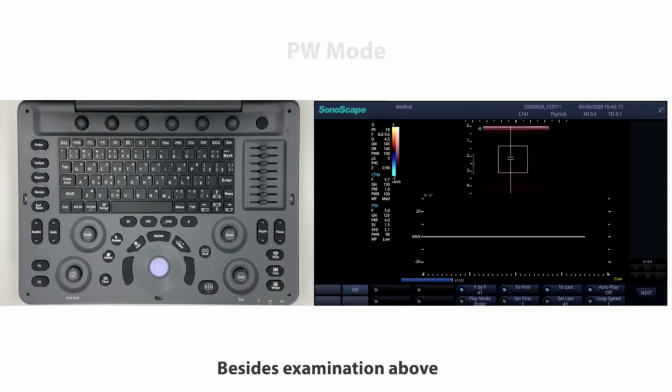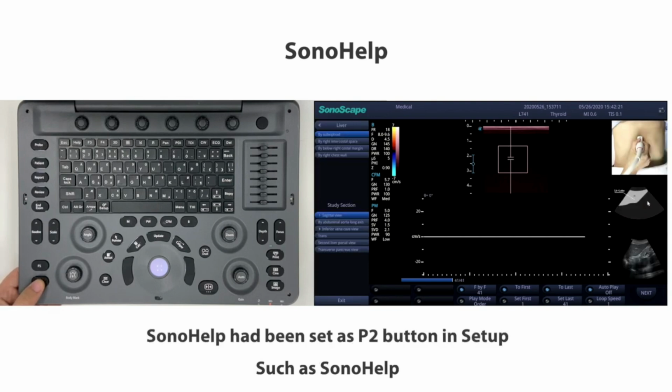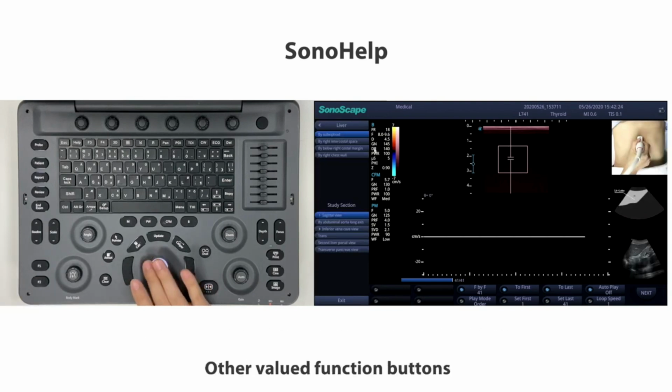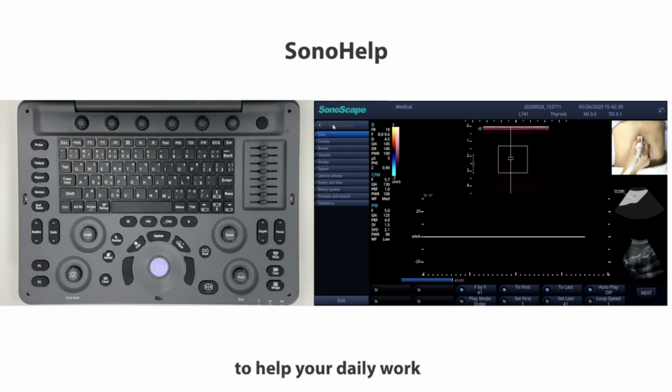Besides examinations above, the E-Series is also equipped with practical functions for your efficiency, such as SonoHelp, which could provide you guidance of exam. Other valued function buttons are also displayed on the keyboard to help your daily work.